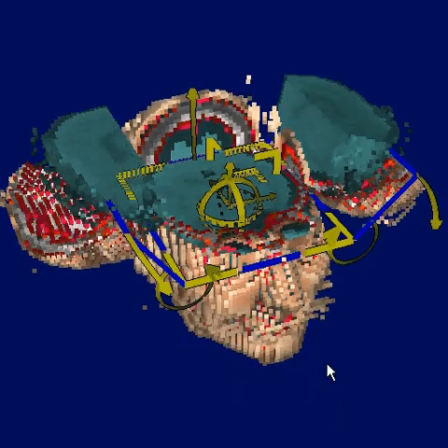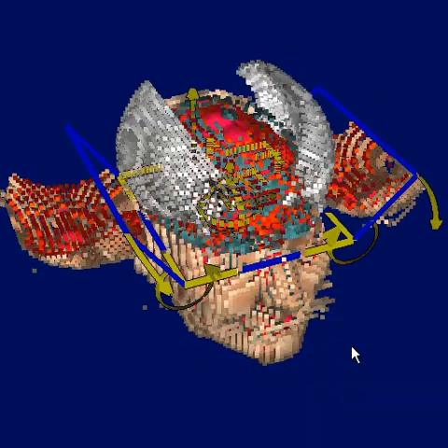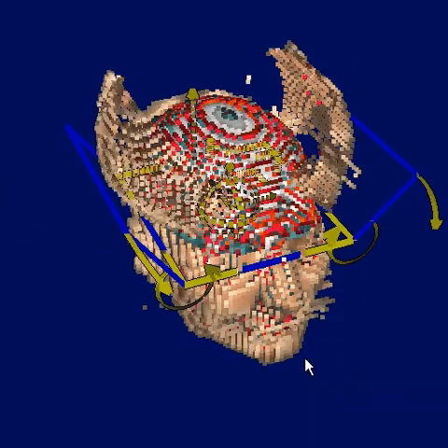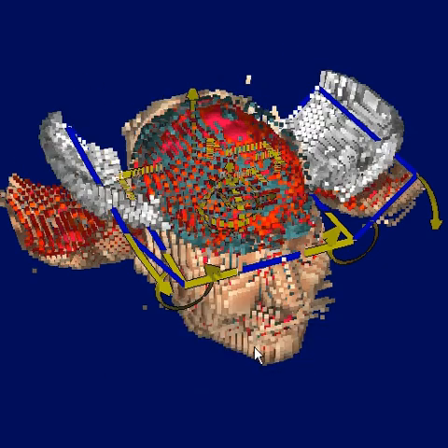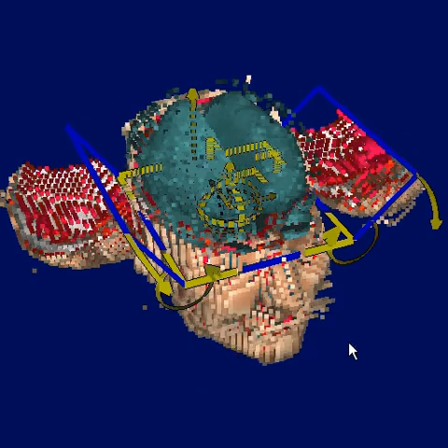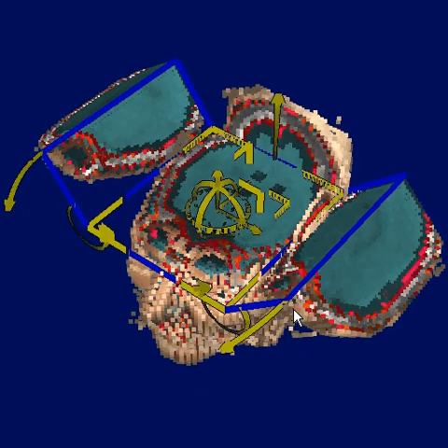We can also unselect layers, in which case they animate back into place. Reselect layers. And this is somewhat like leafing through the pages of a book, which is how this tool got its name.